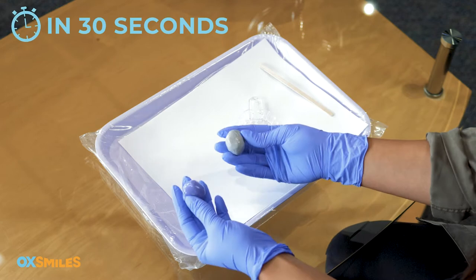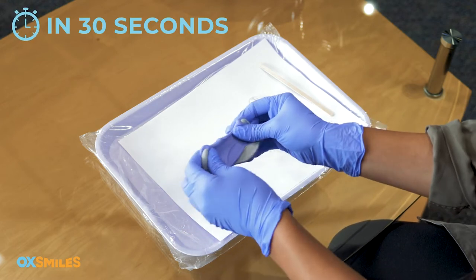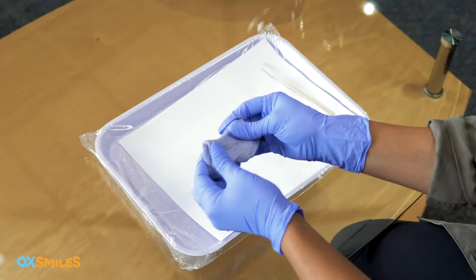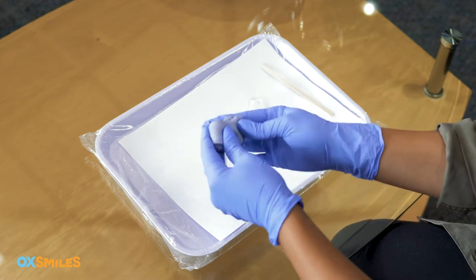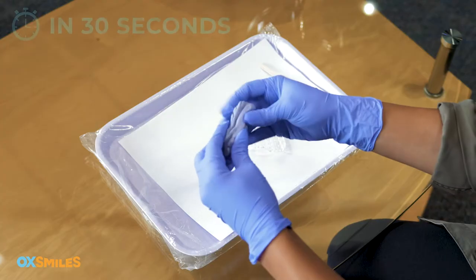Step four: within 30 seconds, mix the A and B putty — knead and fold the putty in your hands as quickly as possible. Don't roll it. This should take roughly 30 seconds to mix the putty into one solid color free of any streaks. This is important: the putty has to be all one solid color.